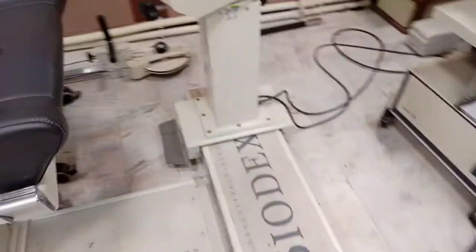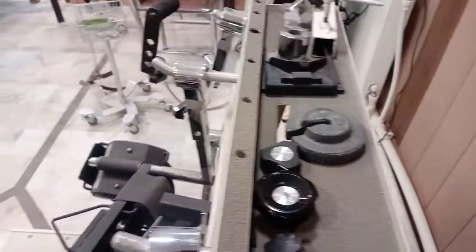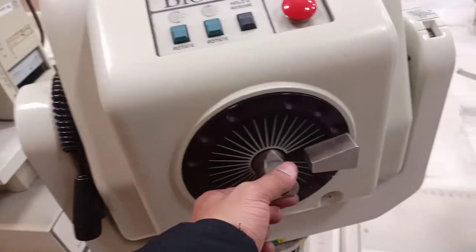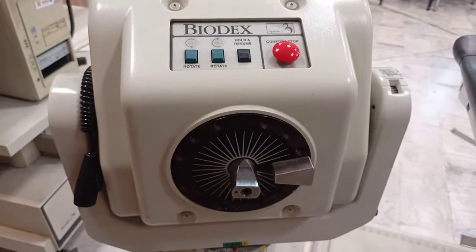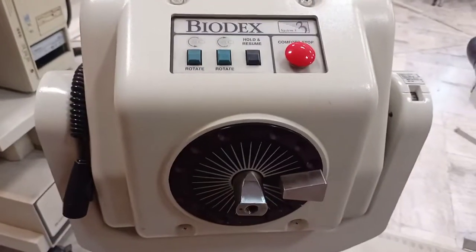Similarly, this is for the dynamometer itself. You can also see some attachments here — these are pulley systems that can be attached, and here are some other attachments with angulations. These are the fasteners that you use to hold the attachments in place. The main rotor and attachment gets connected, then you fasten this bolster and it works. I hope this was a brief overview — I'll try to make more videos including some functional tests as well. Thank you very much.